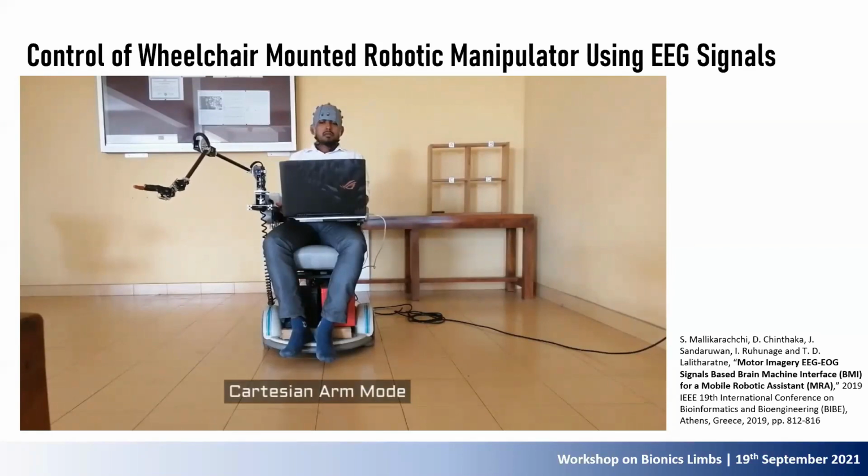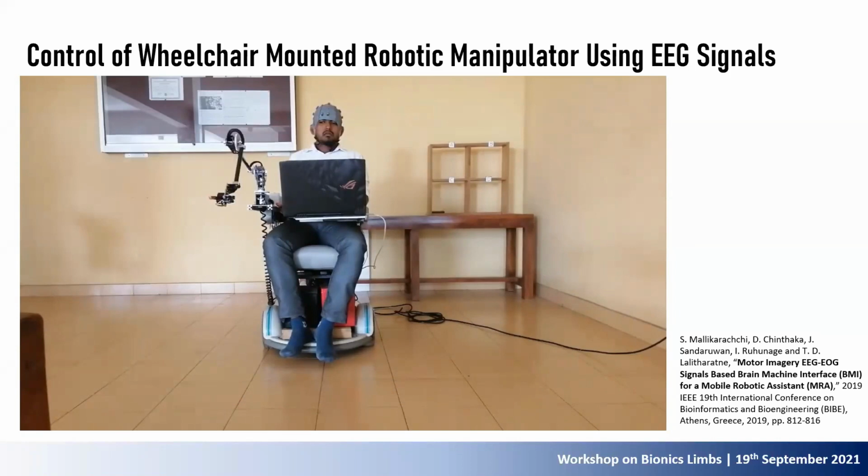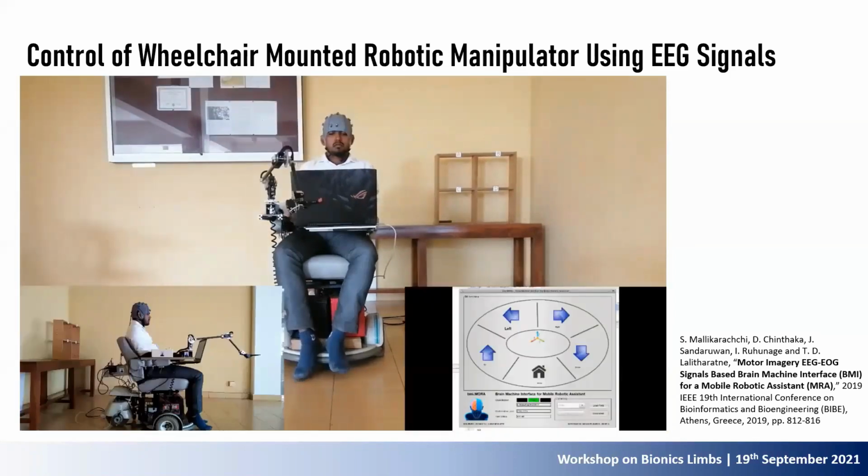And then after that, I think we had to train the algorithm for almost 2 months. As I said, motor imagery based BCIs are pretty difficult to train, and it takes a lot of time. Not only the algorithm, but also the person using it must be trained to emit these EEG signals.